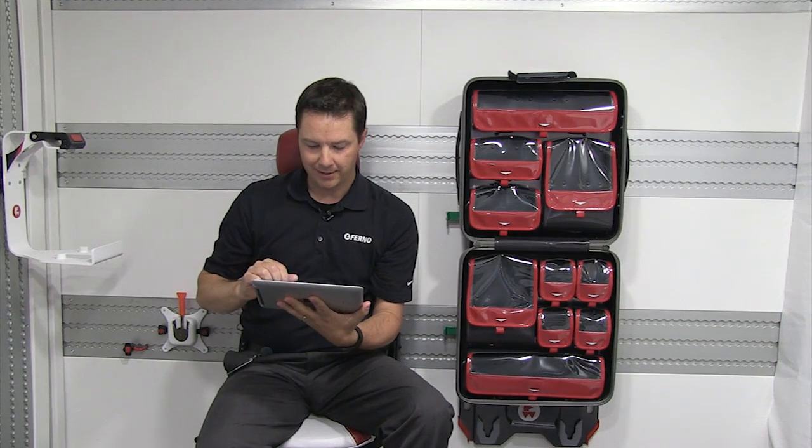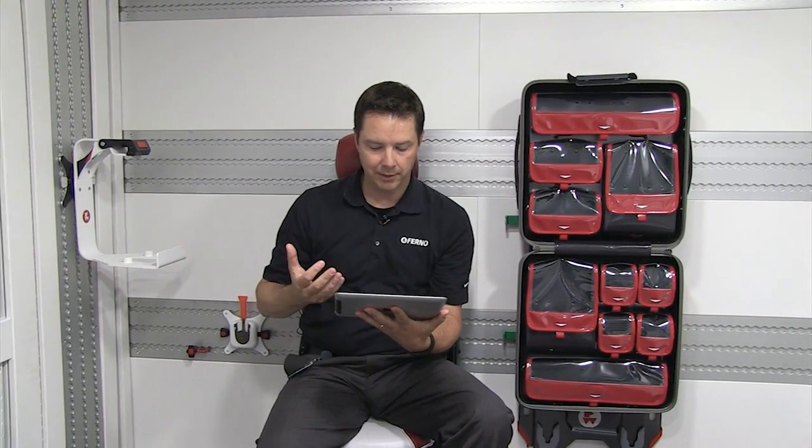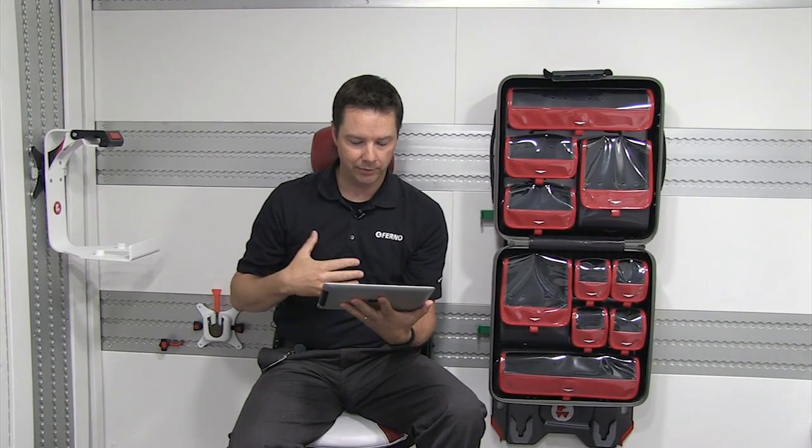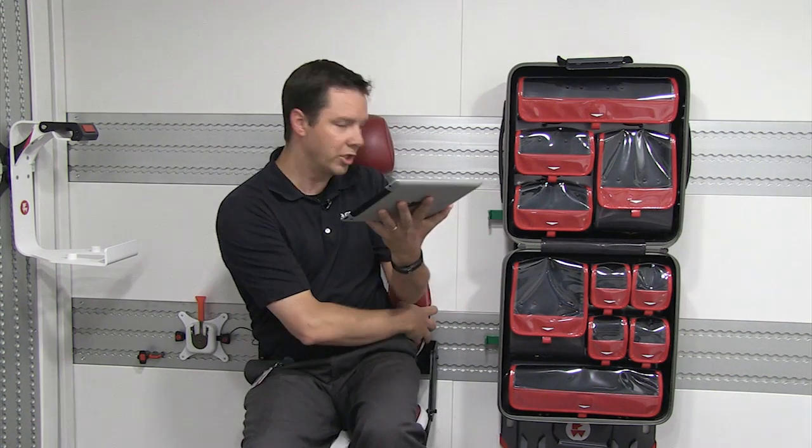Olaf1988 sent in a question, said, will the company ordering be able to customize where the seats are placed, how many secure seats are in the patient compartment? It says, we routinely have more than 2 people in the back of the rig. Will there be any consideration for added team members? Well, I'm kind of sitting on a first prototype of that. This is a jump seat that is clicked into the tracks.